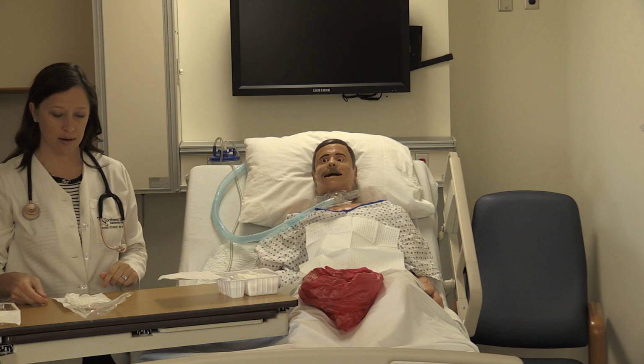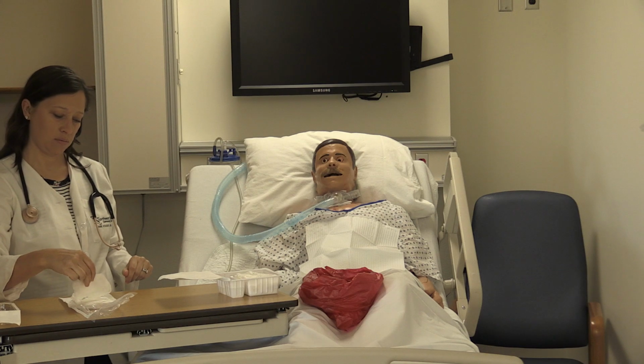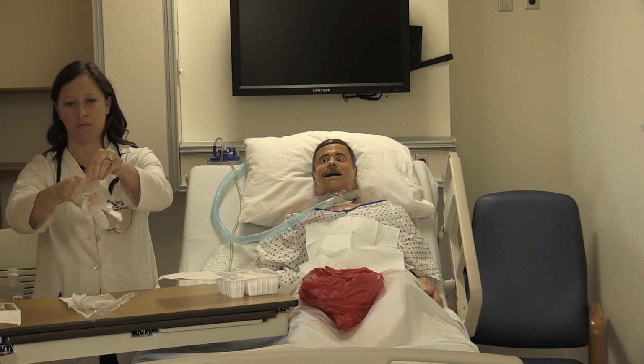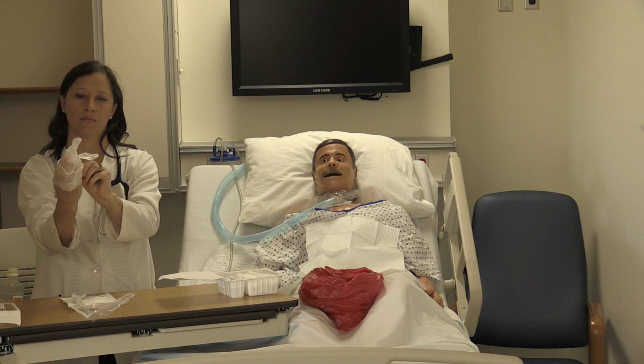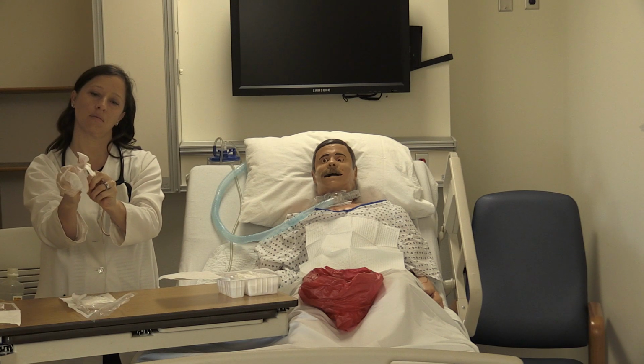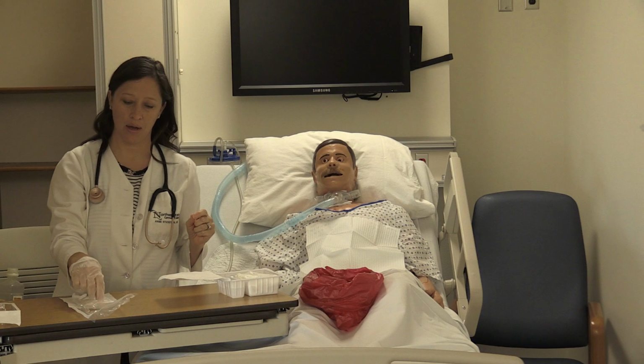So now that I've done that, I want to pick up my sterile gloves. Okay, and then I'm going to get my other sterile glove.